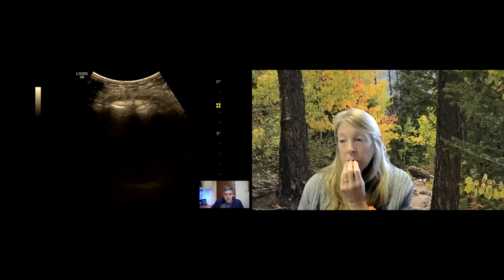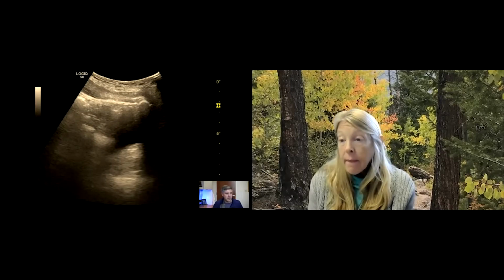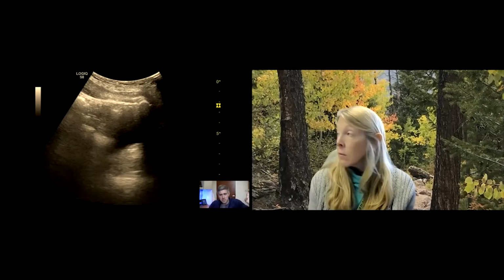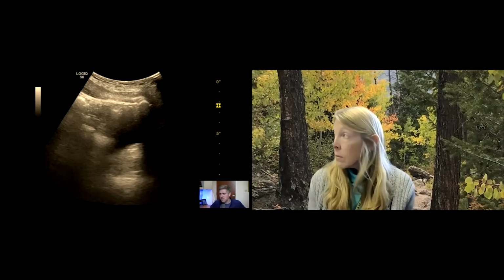And then all I have to do is move my probe a little bit anterior, or north, or cephalad, and you'll fall right into where the bladder is, right? And just to illustrate this in sagittal orientation, here you can see that little knuckle, that little hump. You see the peritoneal stripe coming down from the left, just horizontal to the plane of the probe, right? And then you'll see a little hump about 2/3 of the way across the screen. That's the pubic symphysis, and there's a deep, dark shadow beneath it. And right above that, you can see this anechoic fluid.